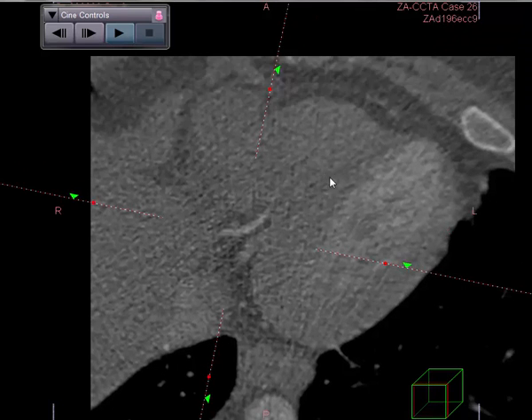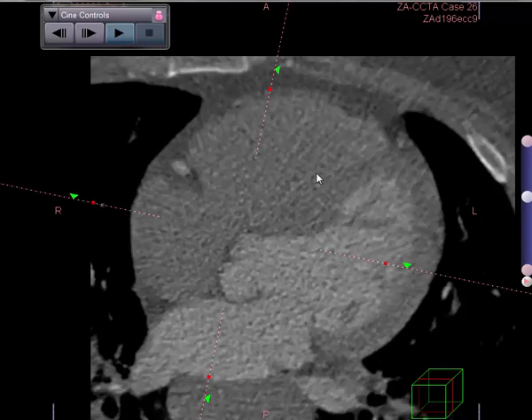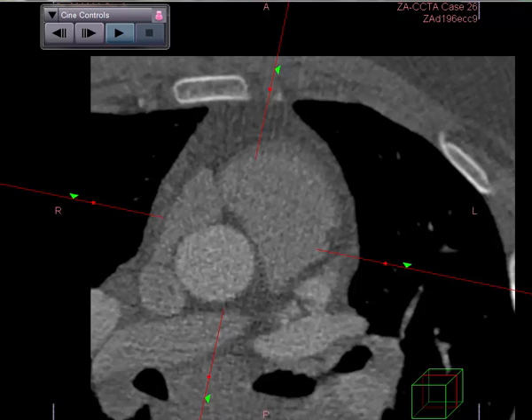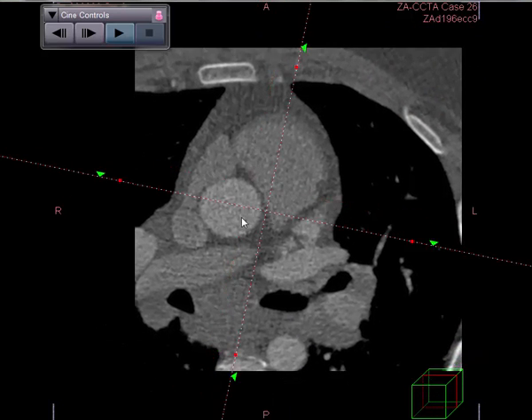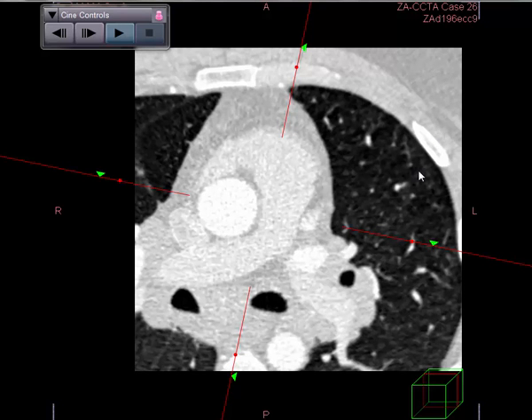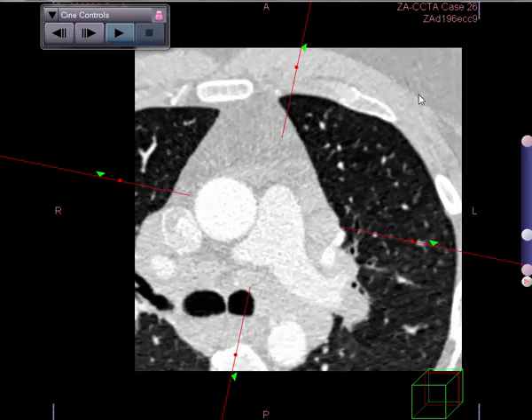The key feature in this patient is not his coronary arteries, which only show mild non-obstructive disease. Let's adjust the view and switch to what is called a lung window. In the lung window we want to start looking at other features. Within this cardiac field of view we need to get a better idea.